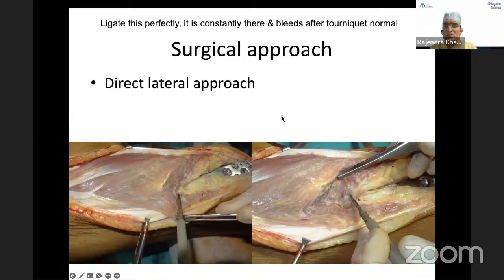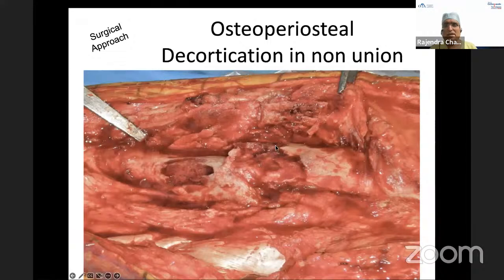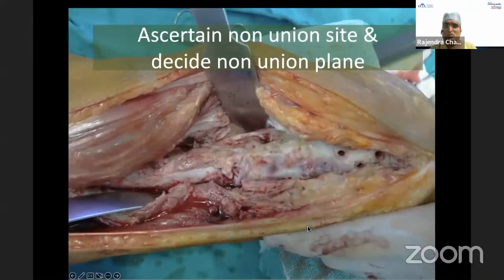So this is what the dissection was. You can dissect, put the angle plate, and then decorticate as is needed with the muscles attached. So that becomes a complete non-union revision with removal of implant. And one piece of advice: where to put the fibula in the distal femur, if you are using fibula for bone loss and providing the medial column. With the angle plate, one important advantage is you don't need to provide medial column stability. You can just use a fibula and insert it. In this case, I had inserted it laterally, but ideally you should insert it onto the medial column. And then it becomes quite nice.